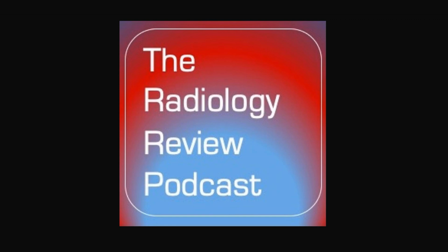Welcome back to the Radiology Review Podcast, your free on-the-go source for radiology board review. On this episode, I will present part 2 of my review of musculoskeletal tumors for radiology board exams.